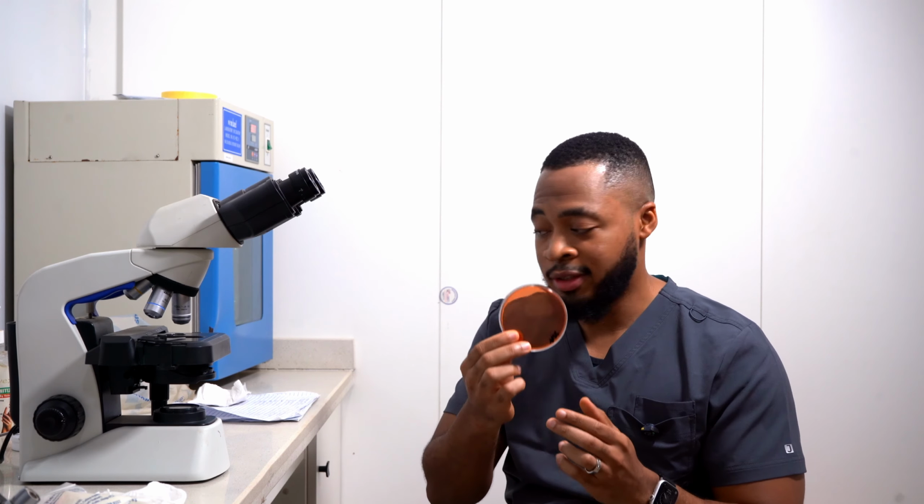Culture is the third step in this process. It's the C in MCS I mentioned earlier. So it involves this thing called the Petri dish. What happens is we take your stool sample and culture it on this plate. We use something called a wire loop.